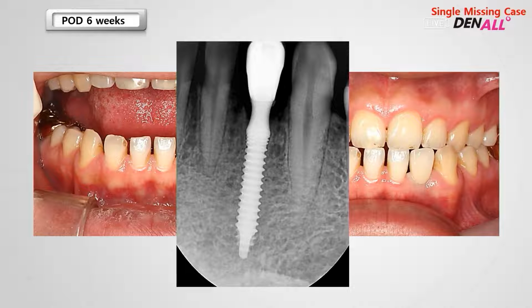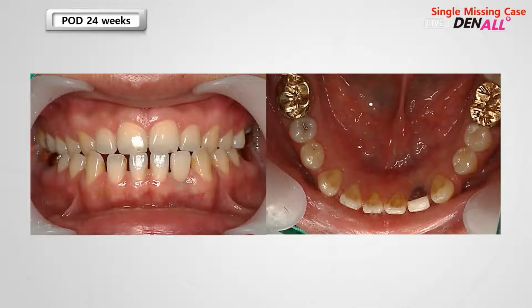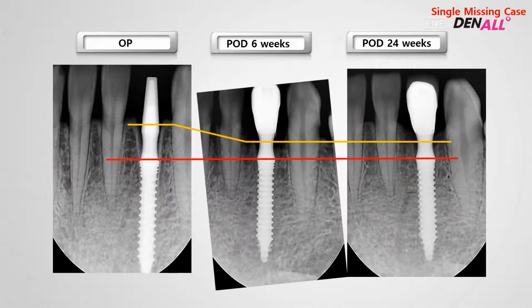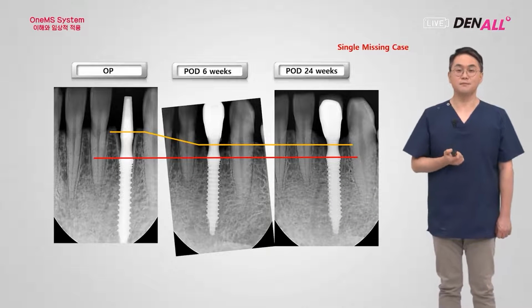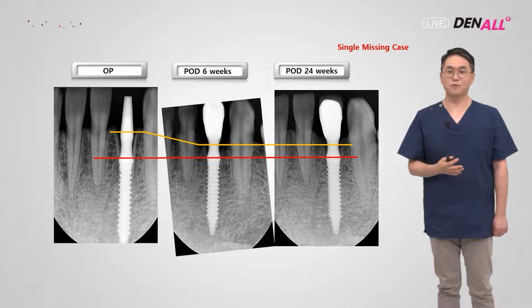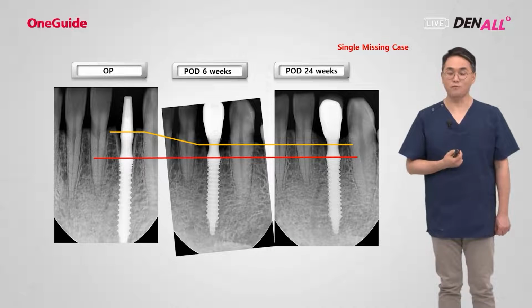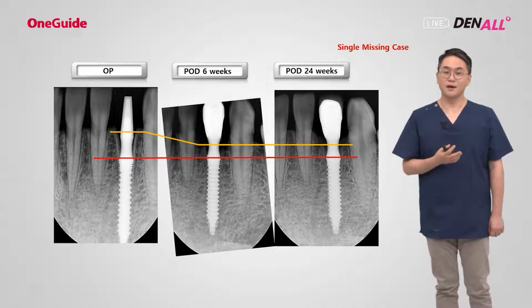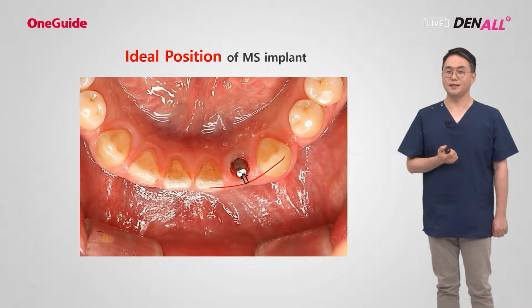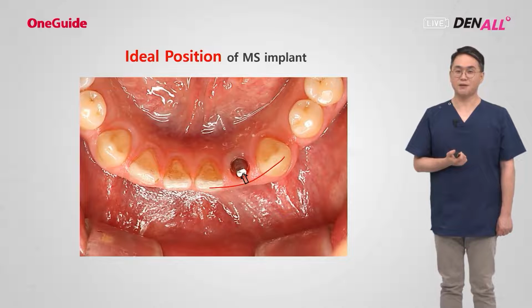Post-surgery, after delivering the final prosthesis, this is the PA. 24 weeks later, you see there is good maintenance, and this is the PA. And as you can see, around the one-body implant, this is how the bone looks. There's not much marginal bone loss. It's well maintained. So on the lower anterior side, in case of a single missing tooth, if it were a thick implant, you would have had to do GBR block bone grafting, but by using the MS implant, such procedures can be eliminated and implant placement can become very simple. But still, the MS implant is very much dependent on the surgeon's experience.